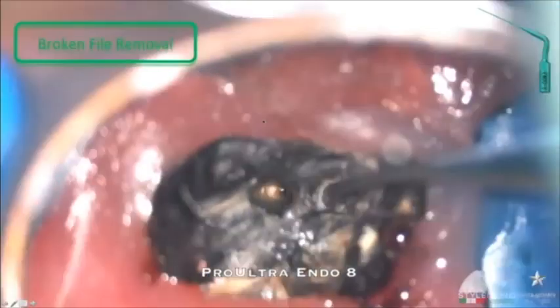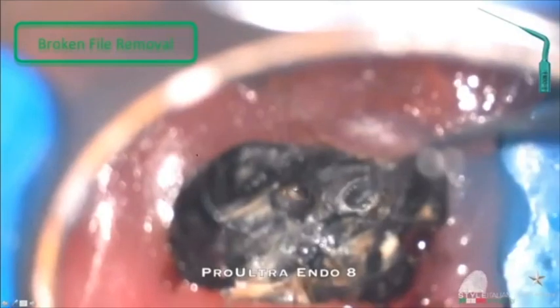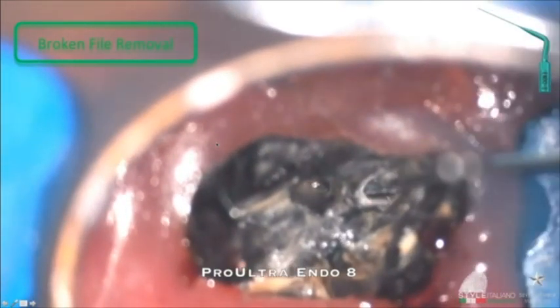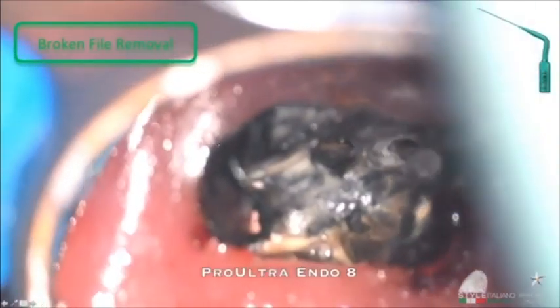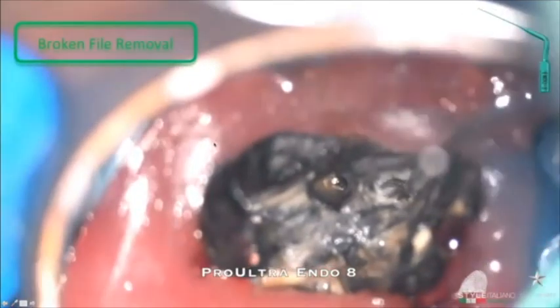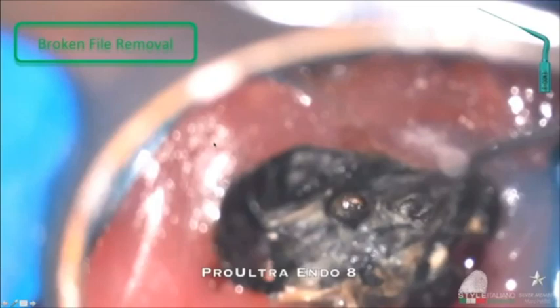So here I'm using the Pro Ultra Endo 8 in the MB1 canal, which is already shaped, and I'm blocking it from progressing to the apical part, and at the same time I'm trying to vibrate it. The only way up is in the MB2 canal, so I'm vibrating it from MB1, trying to get it out from MB2.